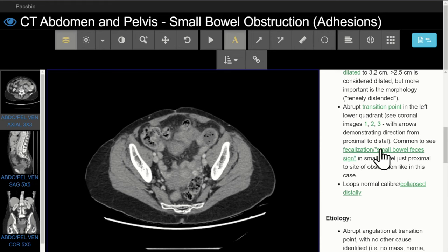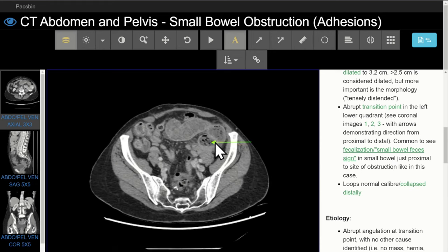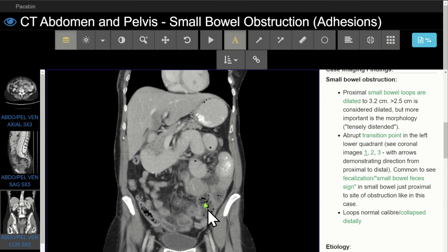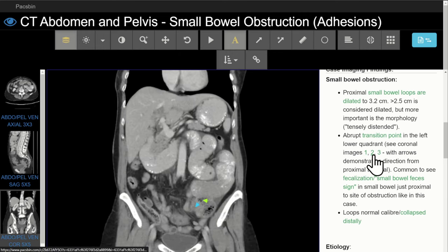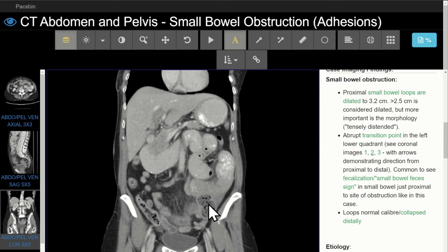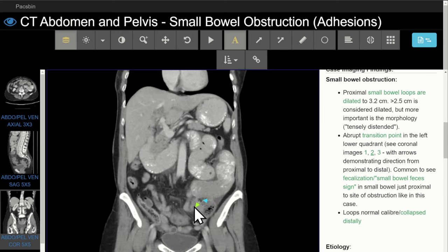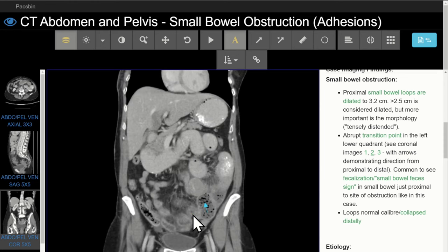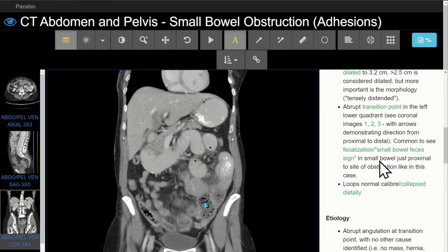It is common to see fecalization or small bowel feces sign just proximal to the site of obstruction, as in this case. On coronal images, you can see that from proximal to distal, the bowel is traveling in the indicated direction. As we scroll through, there's an abrupt change in caliber as the small bowel turns this corner, and then the small bowel emerges after the transition point at normal caliber.